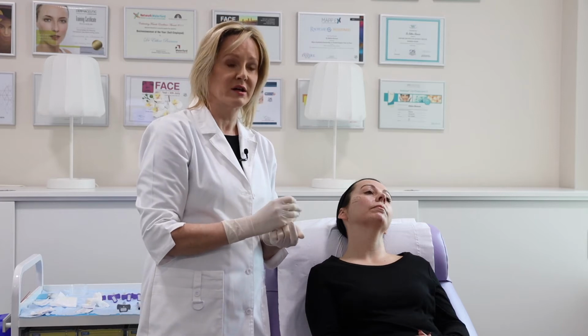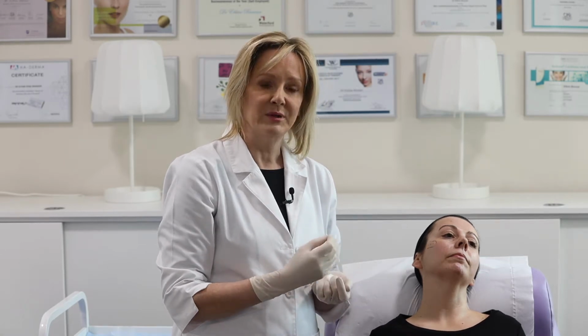I've marked my patient's lid-cheek junction, and I've also marked the zygomatic bone. I've felt for the suture between the zygomatic and temporal bones, and this will be the first point of my CK1, and I've marked about 5 millimeters either side of that. I'll be lifting as I inject. I've done a full cleanse of my patient's face, and I'll also be using alcohol wipes. I want to keep the risk of infection to an absolute minimum.